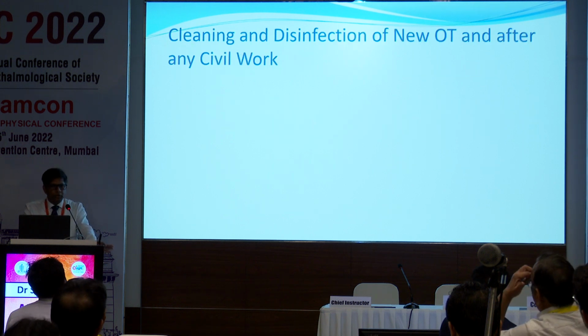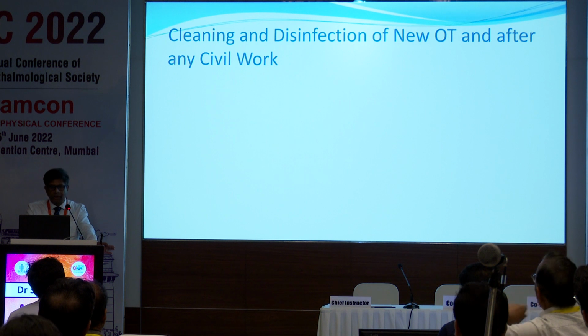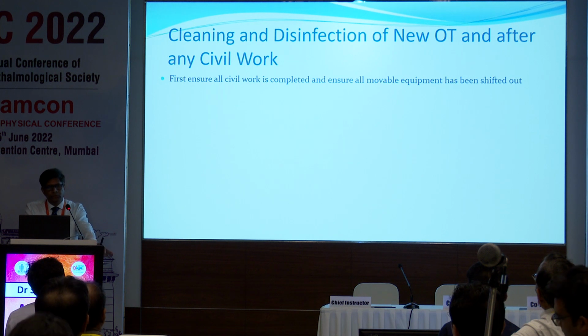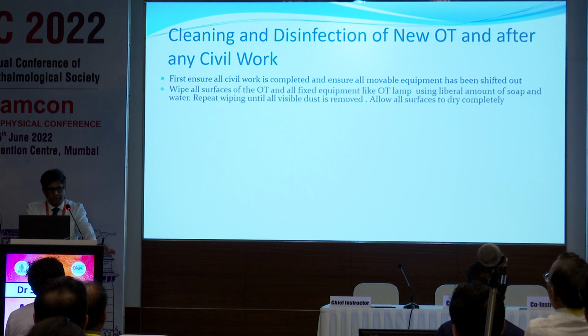So OT cleaning and disinfection can be of 2 types: when you are setting up a new OT, and in a running OT as well. In a new OT, it's a very rigorous step. You have to first ensure all the civil work has been completed and all the movable equipment has been shifted out and cleaned outside the OT.